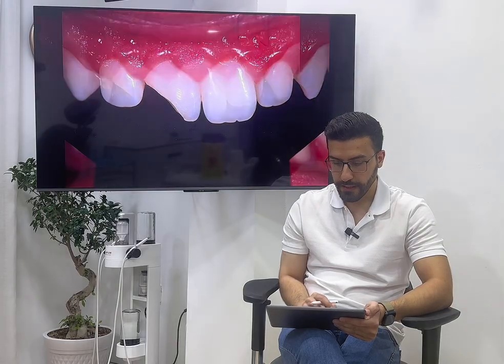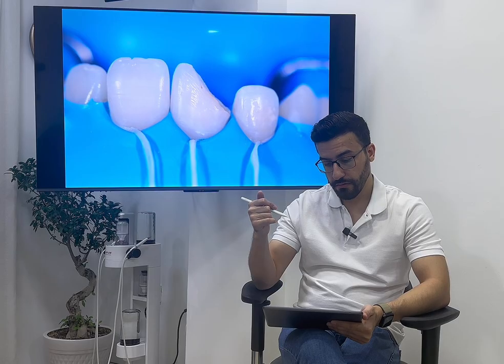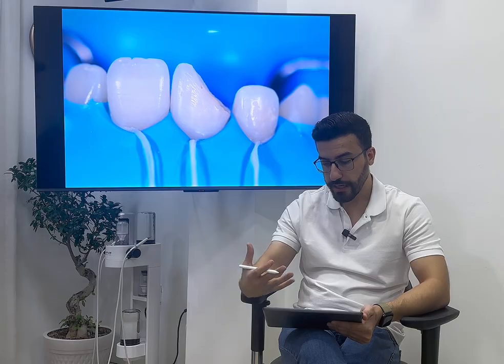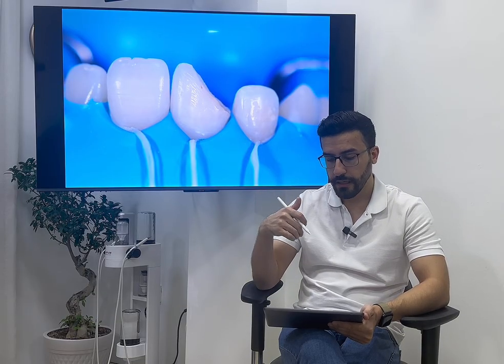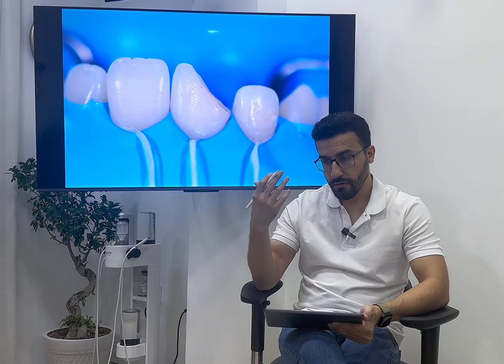Okay, first. Second, I will isolate. Of course, I will do my isolation. The advantages of isolation are, first of all, I have better access. I have better visualization because I have light reflection, and also it's more hygienic, and the result will be much better for me if I use isolation, because I will have no blood, no saliva, no incidence of the patient biting or touching it with the tongue. I have none of that.